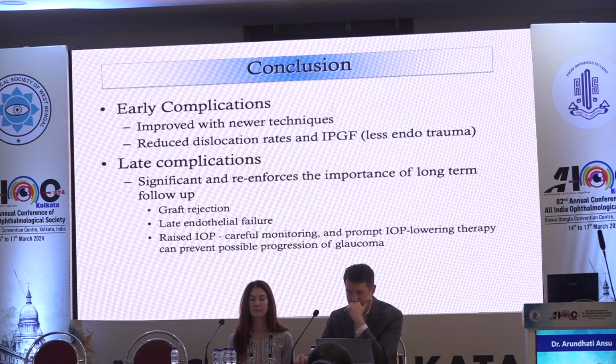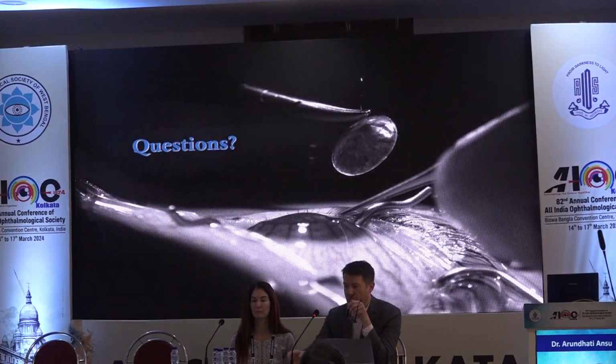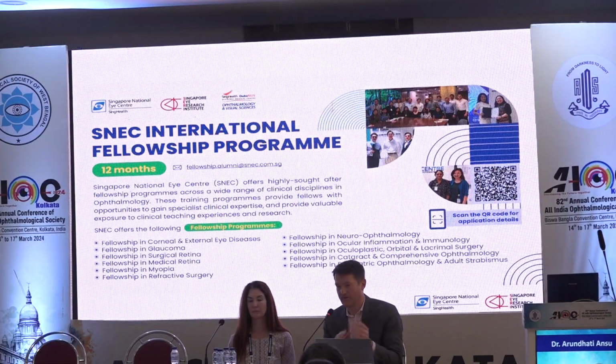So to conclude, early complications can be improved with newer techniques, with resultant reduced dislocation rates and IPGF. Late complications can still happen even with lamellar surgery, so it's important that you have long-term follow-up to ensure that the patients have the best outcome. Thank you very much.